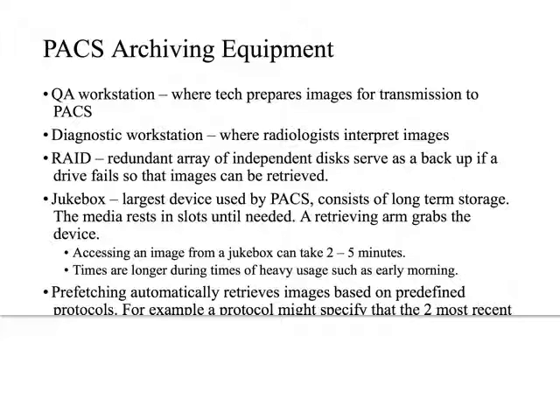An essential part of how this PACS works once things are sent to the archive is prefetching, where the robot automatically retrieves the information. For example, say you had a patient scheduled for a chest x-ray this morning. The prefetch function of the jukebox will retrieve the chest x-ray they had 5 years ago from the archive, so that when the radiologist pulls it up, they're looking at both the chest x-ray done today and the one from 5 years ago in rapid sequence, not waiting 5 minutes between the two. So there's a lot that goes into a RIS and a PACS system beyond just data entry. There are artificial intelligence processes already embedded in the systems.